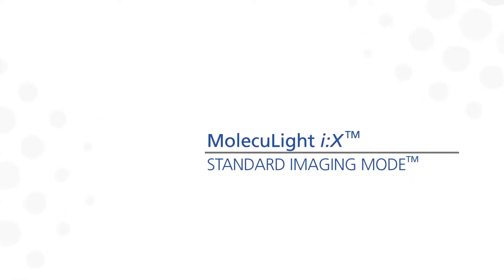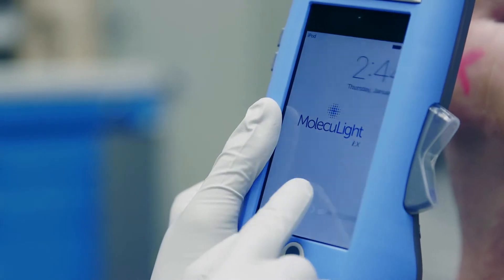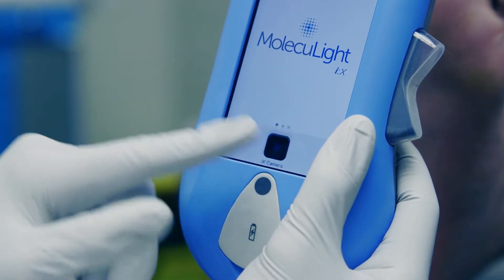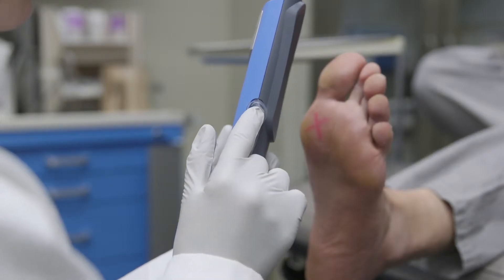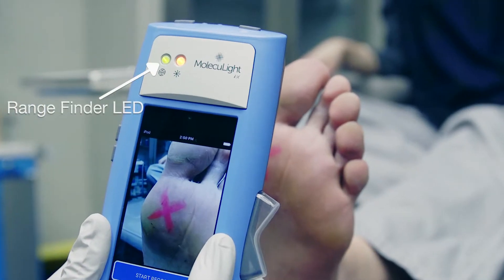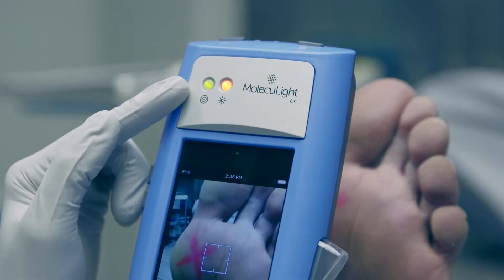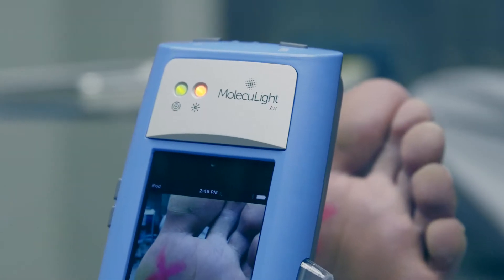Beginning with a standard light image, first press the home button to turn on the display screen. Then slide the slider and select the iX camera app. Ensure the rocker switch is in standard mode by toggling the rocker switch up. Then watch the rangefinder LED as you move the device to and from the wound. You'll see it change from amber — meaning the device is too far or too close to the target — to green. When the rangefinder LED is green, you're at the correct distance to take the photograph.